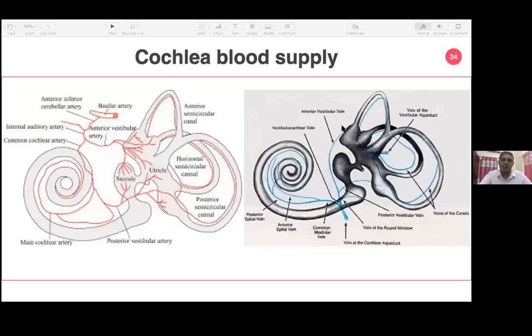So if the venous drainage is impeded, or if the blood supply of the cochlea is compromised by any procedure on the bony cochlea, or by a traumatic insertion, a very rude or very fast insertion displacing the cochlear fluid dynamics, this can also cause insult to the cochlear blood supply, causing reduced performance of cochlear implantation later on.